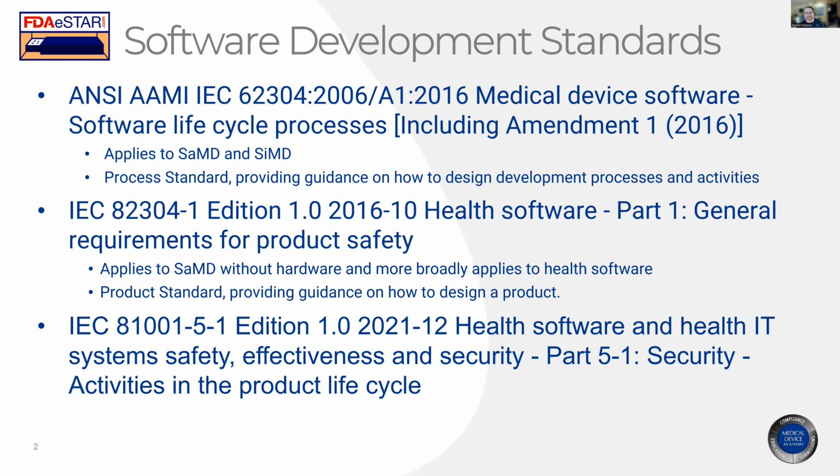That is the basis for classification of software as well. So you have your A, B, C classifications, and the FDA even says in their guidance documents that they expect you to have a process that's compliant with 62304. So there is no way around this. Even internationally, that's what the expectations are. So when you have medical device software, this is what you use.